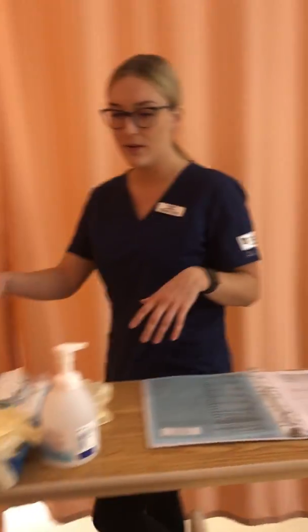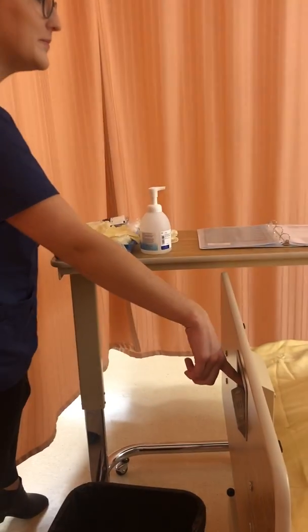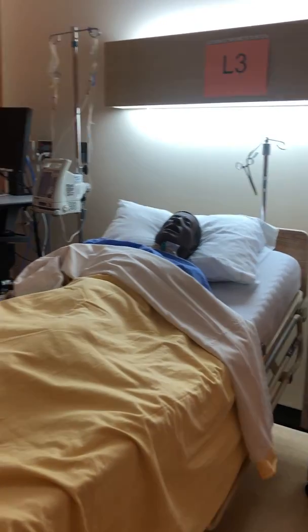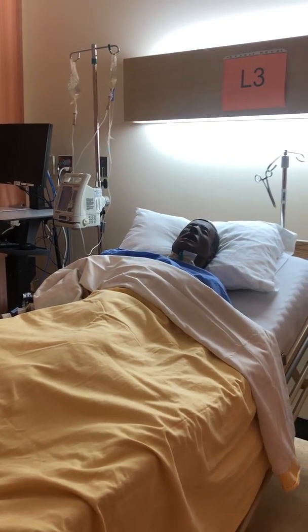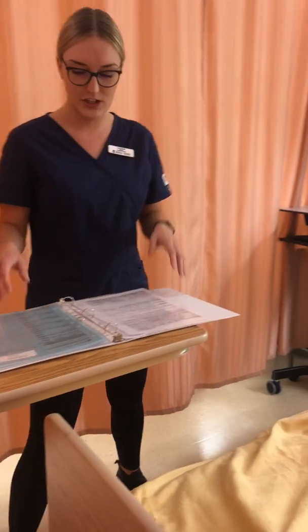I'm going to move his bed up to semi-Fowler's. And the bed is in the lowest position, and the side rails would be up. For demo purposes, I'm going to keep them down so I can work on him here. So we're going to start off with the insulin administration.